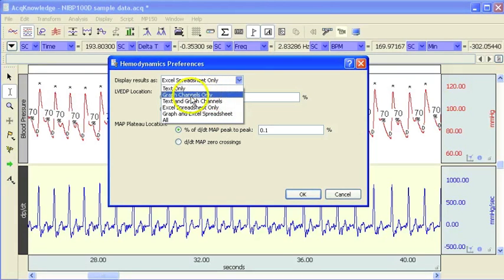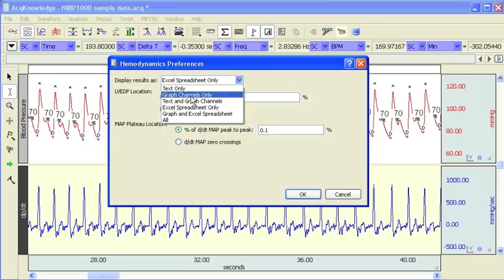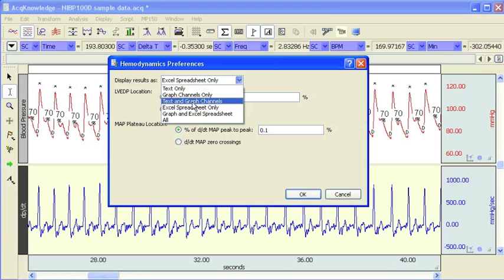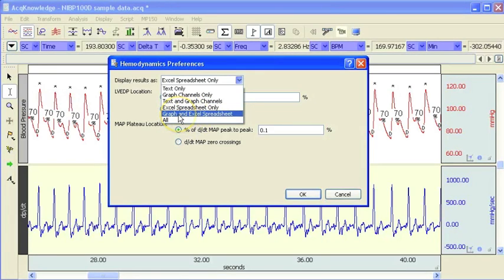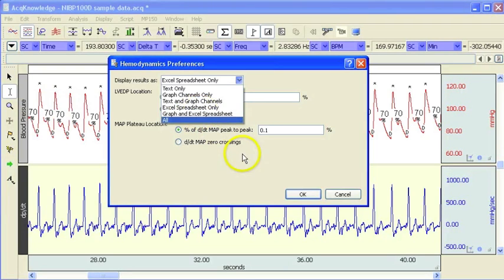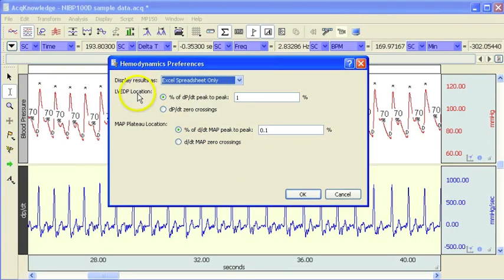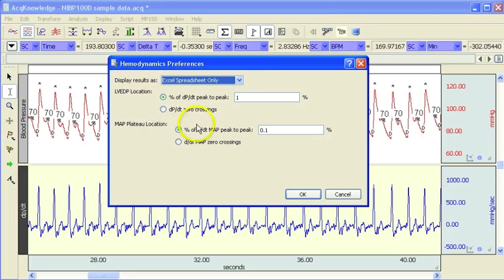And we can also plot just the measurements that we've taken as new graph channels. So we would see a new channel for systolic, diastolic, mean, et cetera. And we have the option to do both. So we can paste the measurements down into a text file and also display them as a new graph channel. And then finally you can do the same, graph the values and export them to Excel. And these additional options relate to other hemodynamic measures.